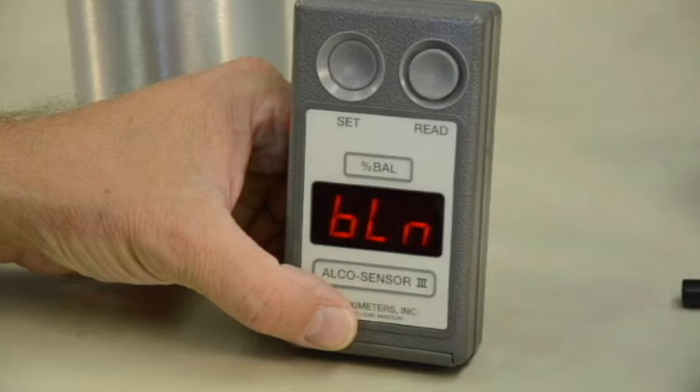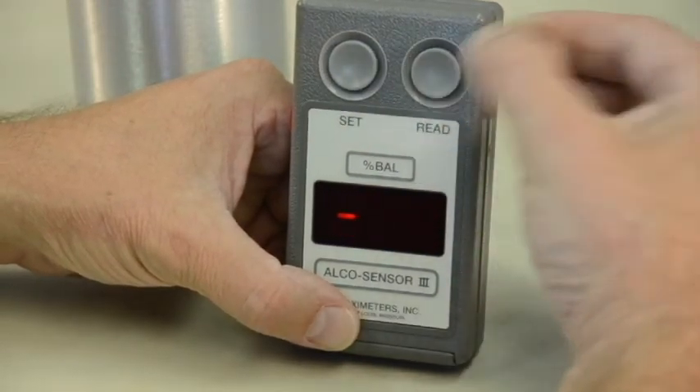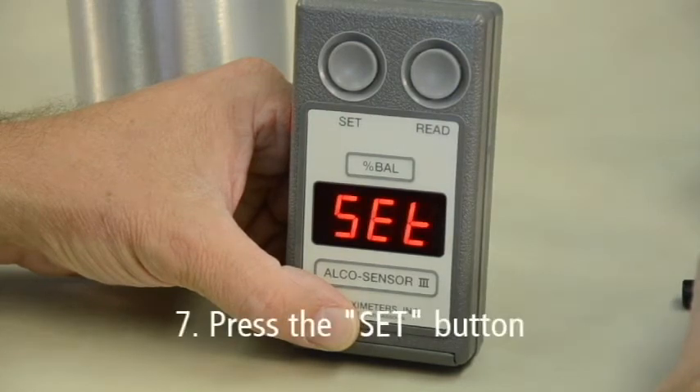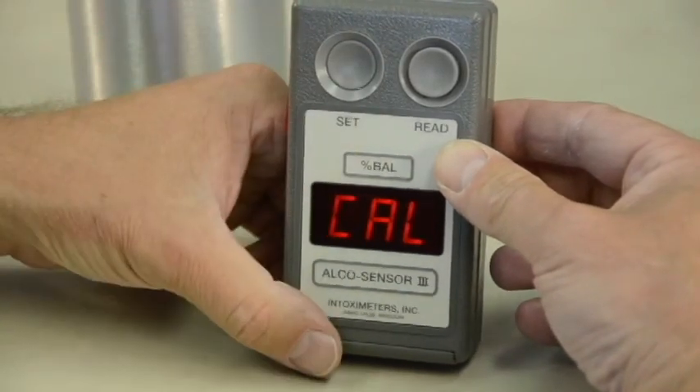If, however, you were successful, you are ready to perform an air blank on the device. An air blank is a procedure that checks the device for any residual alcohol that may remain from a previous test. Press the read button. A moving dash indicates a sample has been taken and is being analyzed for alcohol content. Set will display. Press the Set button. Then C-A-L will display.